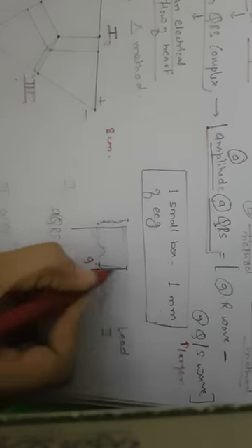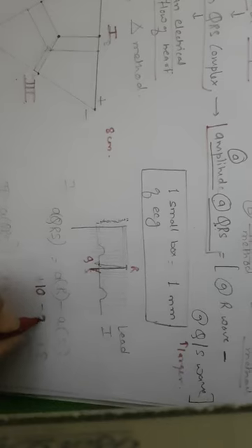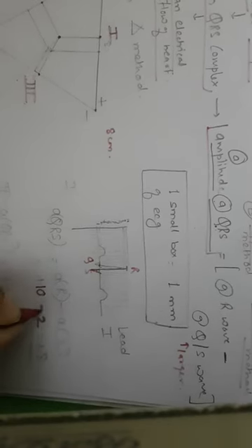S wave. So Q R S. It is occupying two small boxes, so 2 mm. As it is a negative wave, plus 10 minus 2 is equal to plus 8. Okay, so this is how we are finding out the amplitude of QRS complex in lead 1.